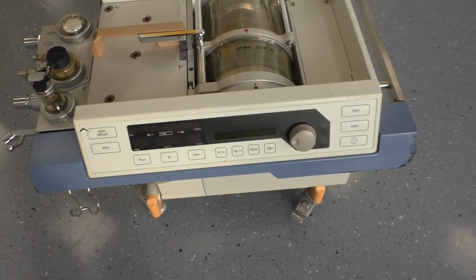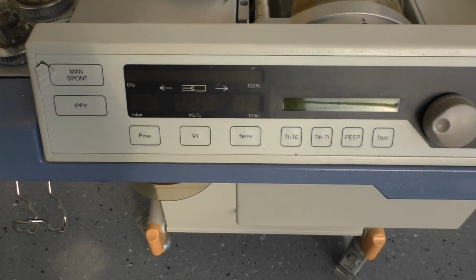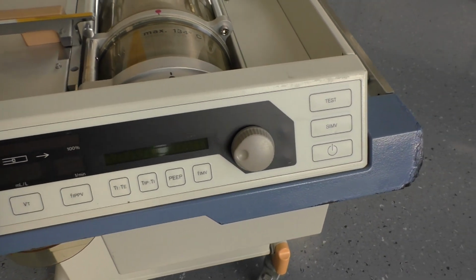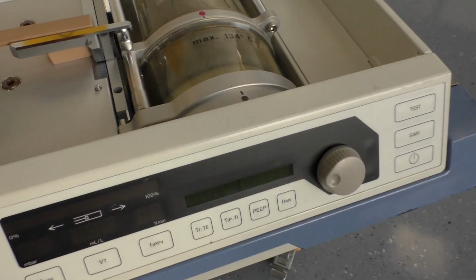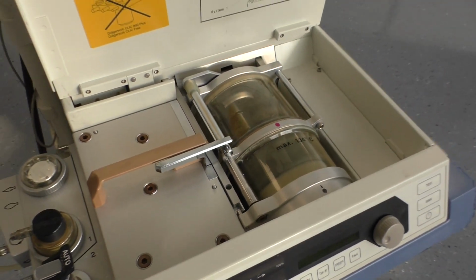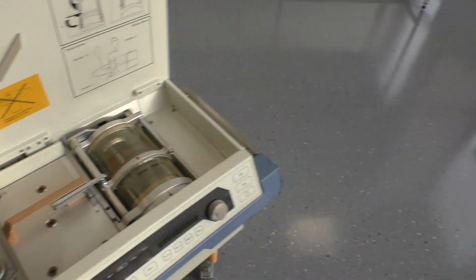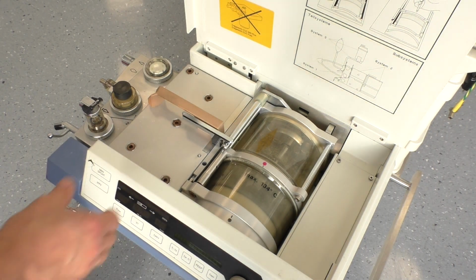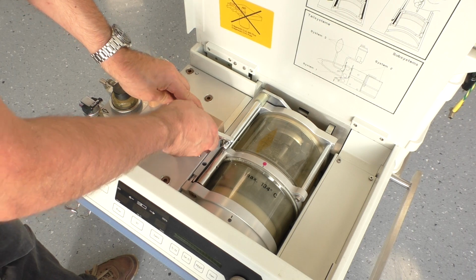Here is the control panel. Unfortunately, this machine has no power supply, so we can't play with it. It doesn't show anything. Well, let's take it apart. I'm not a specialist for these medical parts, but well, we will see how it works by looking inside.